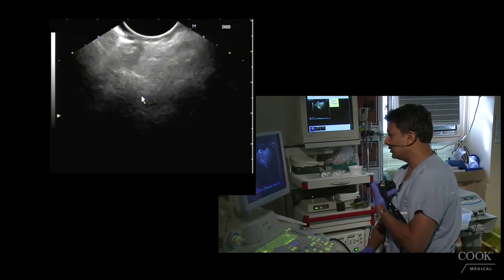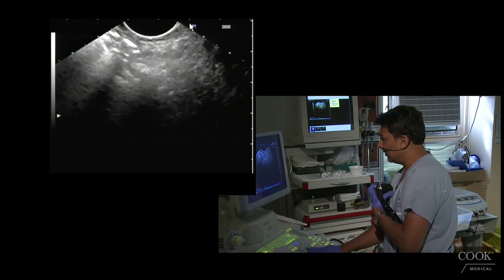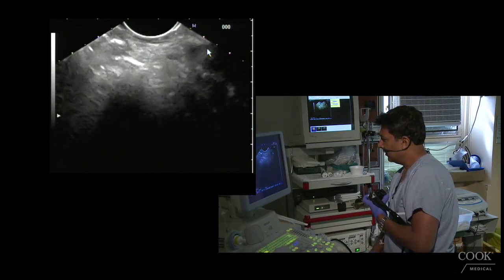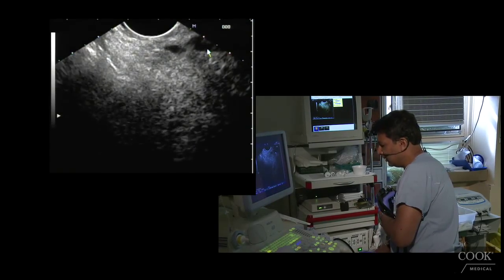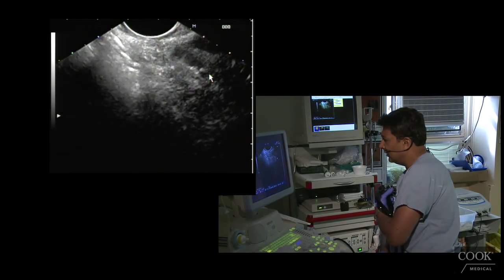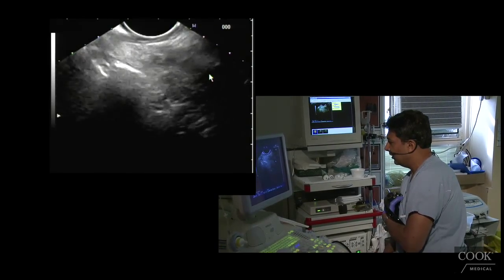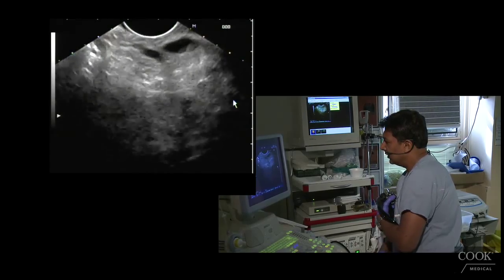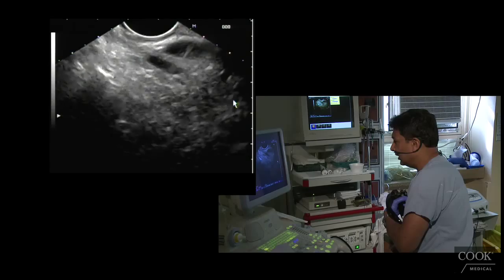So coming across, just looking around. When it starts getting a little darker around here, you know you're getting to the pancreas, to the ventral pancreas. Okay, there's the PD and the bile duct going to the papilla. Bile duct, PD there. So the duodenal wall is right here. So from this view, you can see there's nothing obstructive down there. This is all the uncinate process under here. And this looks good. So just really nothing too exciting here.